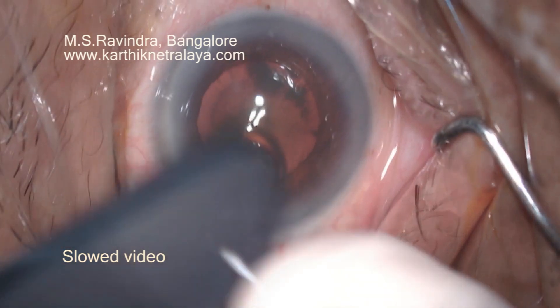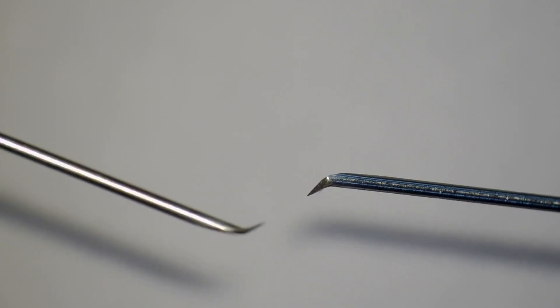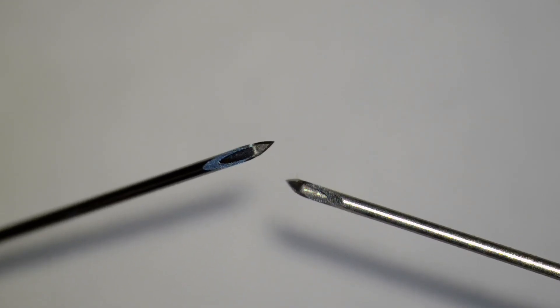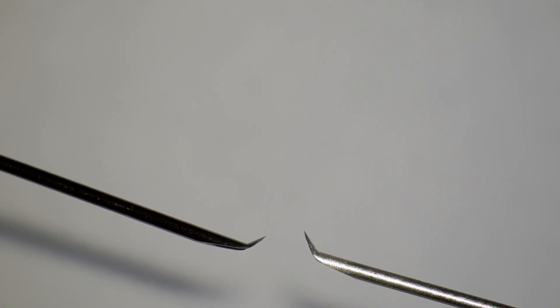This is also a very useful way of creating a good cystitome for the tunnel and floor entry technique. The tip is exclusively sharp and it should not touch any hard surface, as you can see there. Then it will be very easy to perforate the floor of the tunnel as you pass through the tunnel and the limbus.